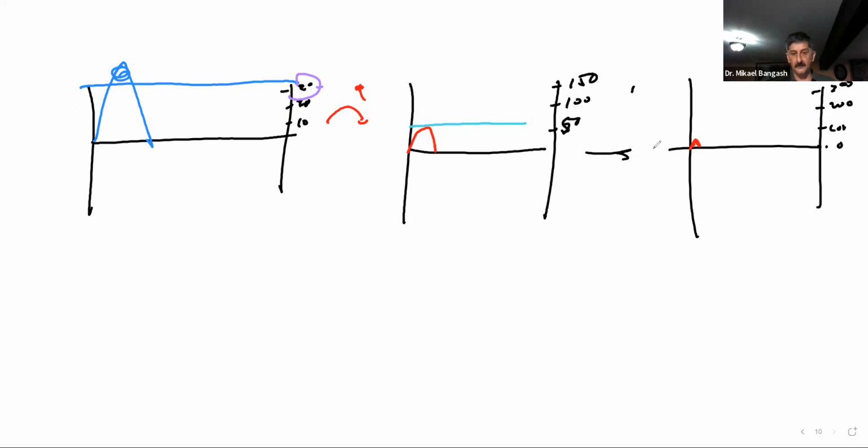We increase the scale even further, even that smaller graph is going to become even smaller. And some of you will say, so what is the disadvantage about that? The disadvantage here is that your system will be less and less likely able to record velocities in blood vessels where the velocity is low.